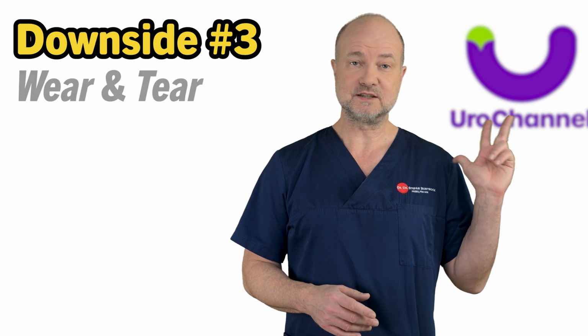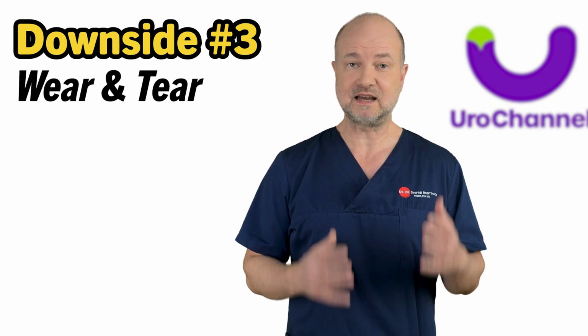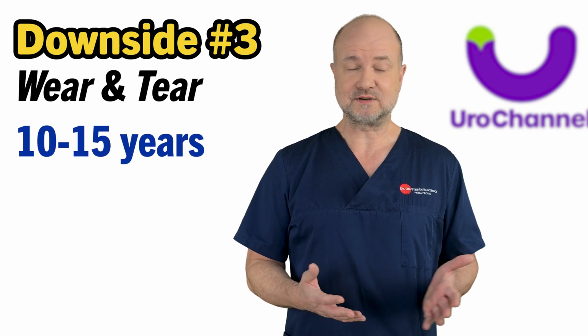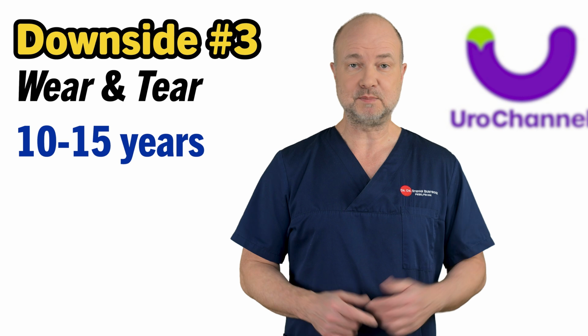Downside number 3 is wear and tear. Like any medical device, a penile prosthesis has a lifespan. Most last around 10 to 15 years depending on use, and will eventually need replacement.